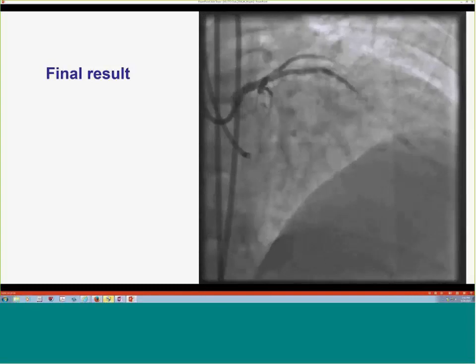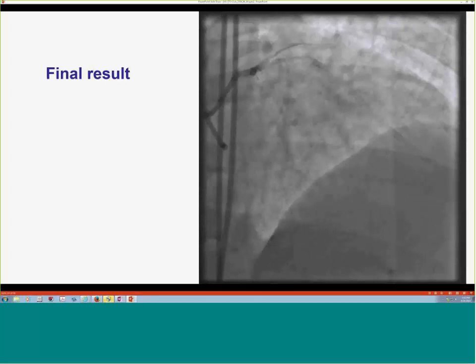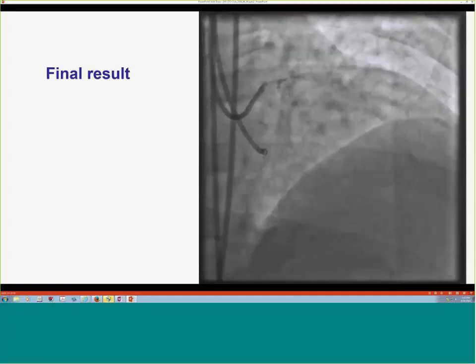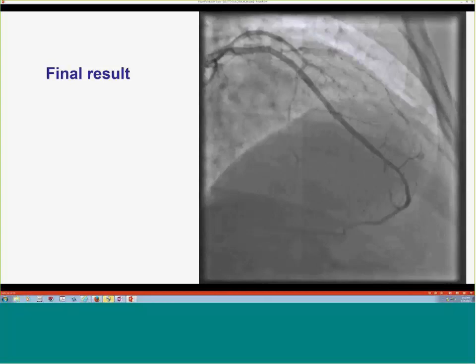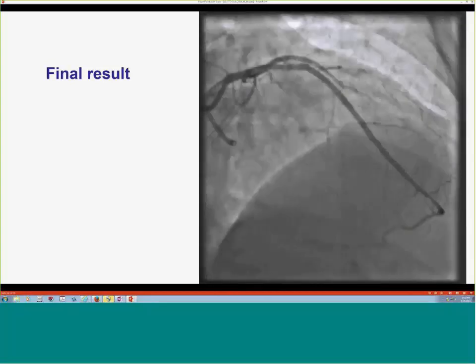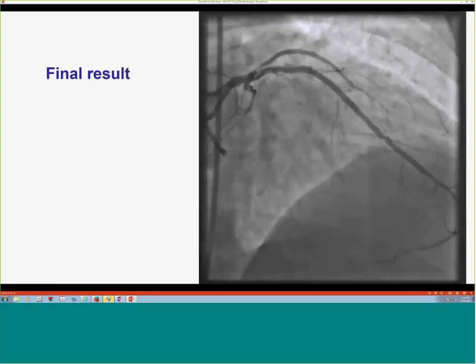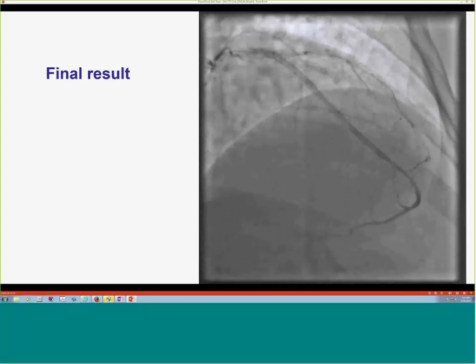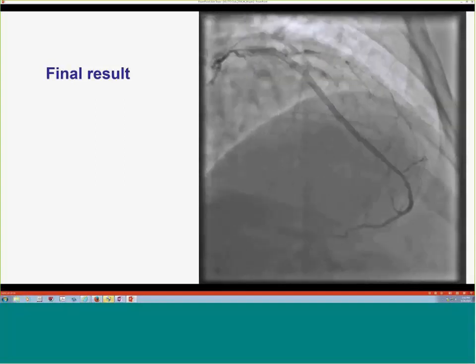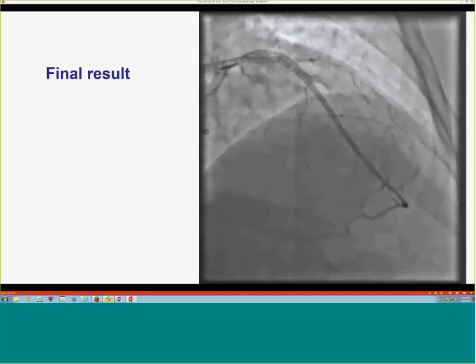Better. Of course, now the downside is, I think what Santiago was saying, now we're kind of in the bypass perspective. I don't think we are having much bypass perspective here in the LAD at least, because all you're left with is a very distal part. So that's always the trade-off here. But again, at this point, I think it looks pretty good, Manos. Hopefully you won't need bypass in the future. He was not interested anyway.